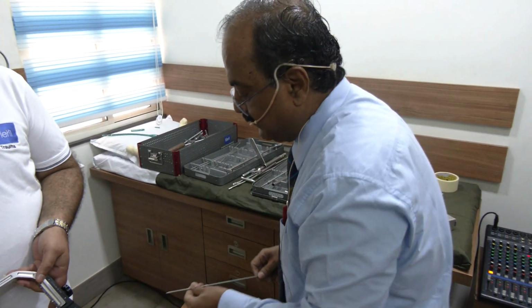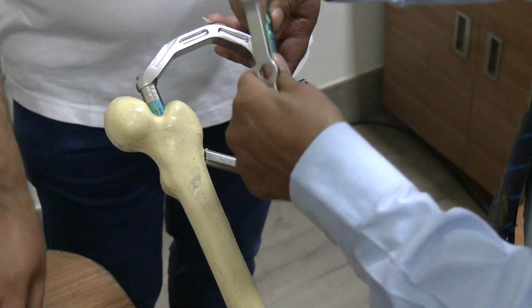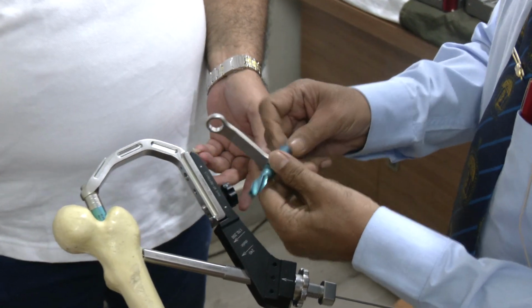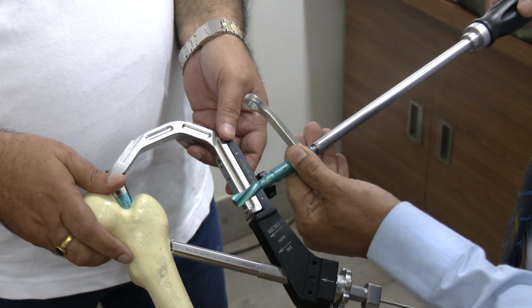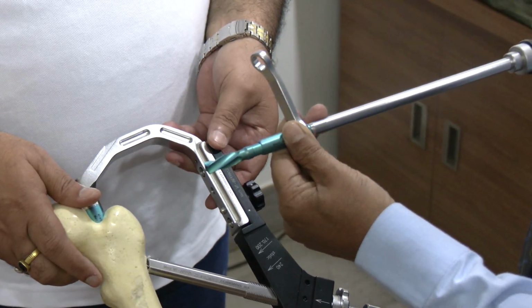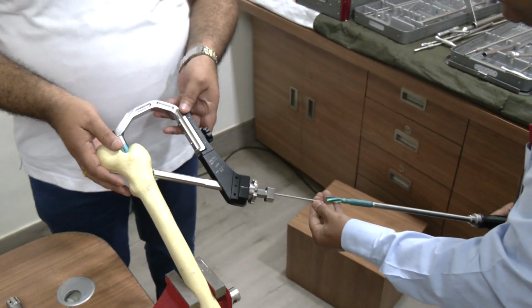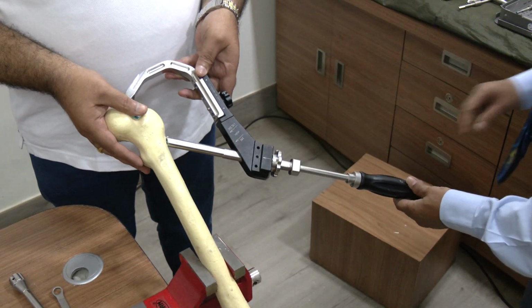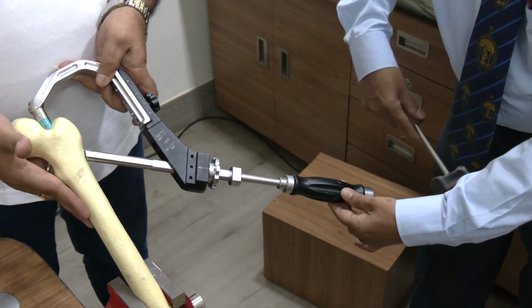So the guide wire has come. Again, I am passing the guide wire. Now again, I am showing this is totally locked at this stage. It's not moving. So with the screwdriver, I am going to take this out. While taking this out, you can see that I am rotating anti-clockwise. Now you can see this is loose, and now I'll pass this and hammer this. With counter support, I just have to hammer, nothing else.